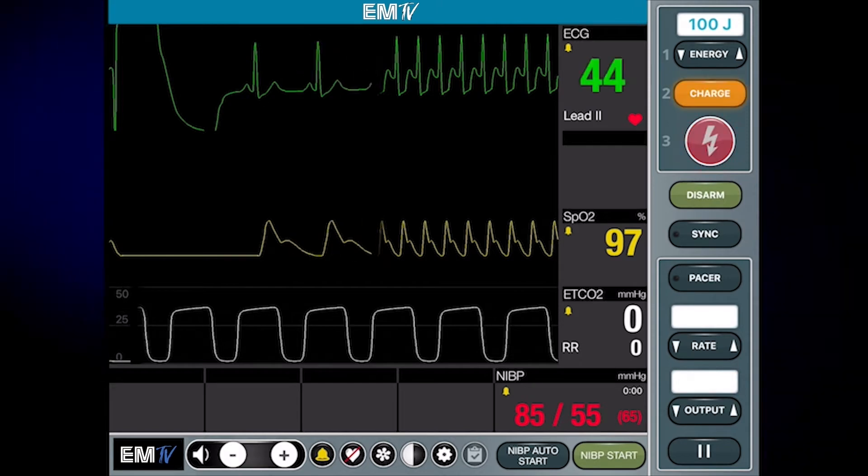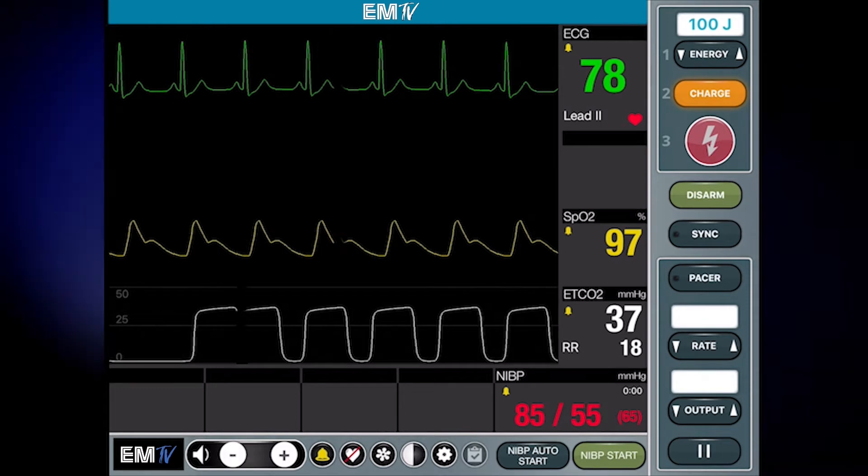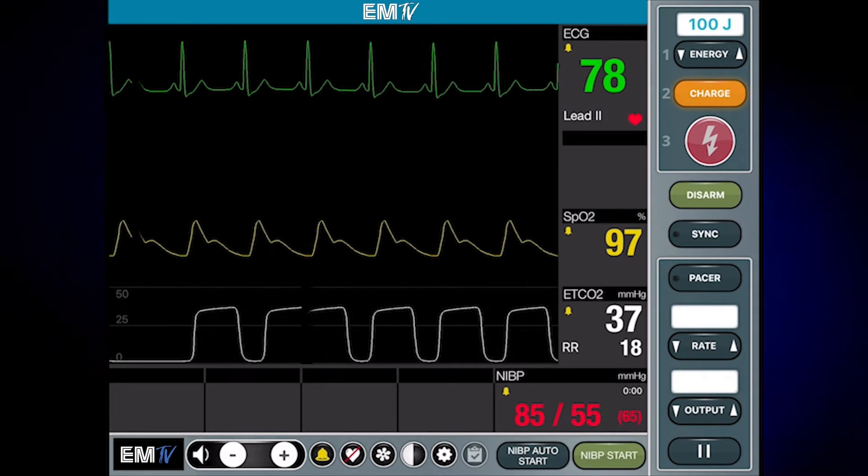Forgetting to press and hold during synchronized cardioversion may result in a failure to deliver the shock. Reassess your patient's condition and obtain a new set of vital signs.